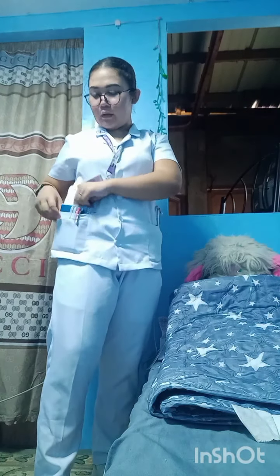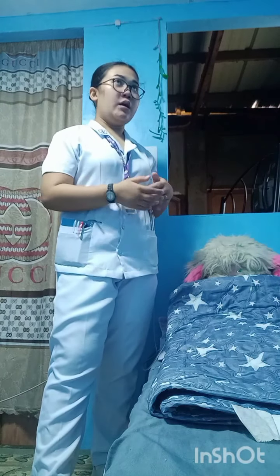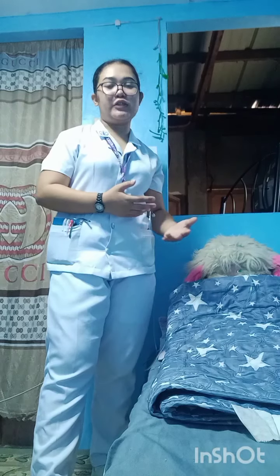After that, we're going to assess the client in 15 to 30 minutes depending on the condition of the client. So, kung mas komplikado yung condition ng ating client, maaaring nasa 15 minutes kailangan natin siyang i-check.